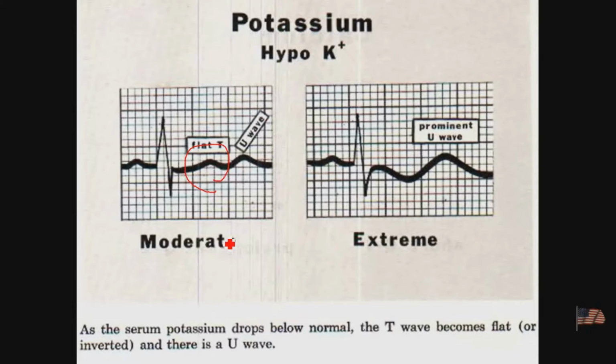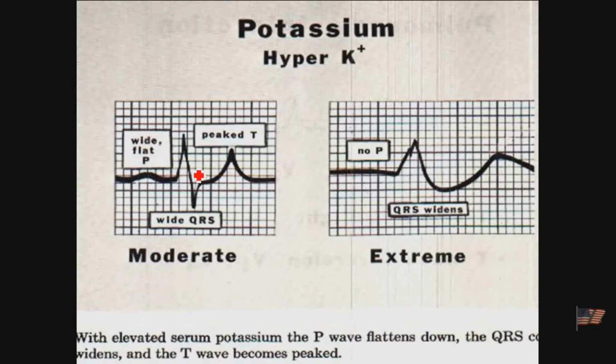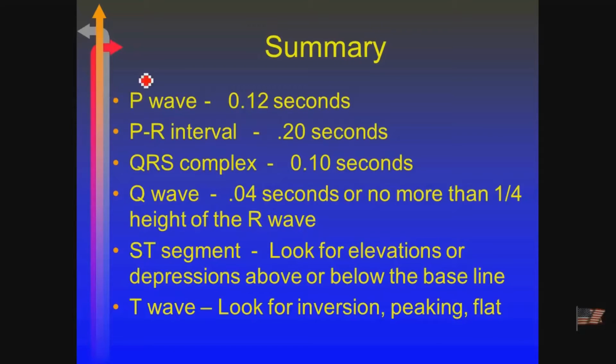Flat means hypokalemia. And you can actually get it to the point where you end up having a depressed or inverted T wave in that case. When you're seeing a tall peaked T, you have a situation where you have a high potassium. So think of the level of potassium as how big the T wave becomes. If it's small and flat, it's a low. If it's tall, you end up having a big one. Okay? That's an important slide there. And again, this is maximum. A max of 0.1, a max of 0.2.